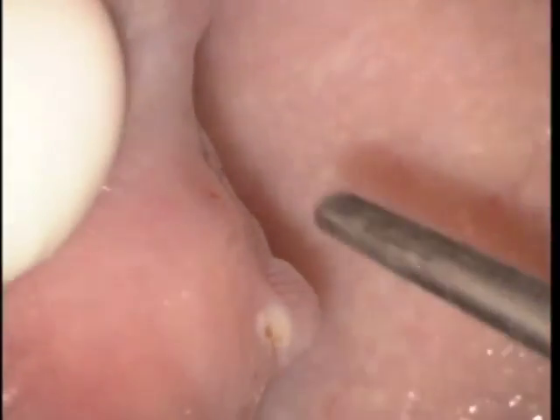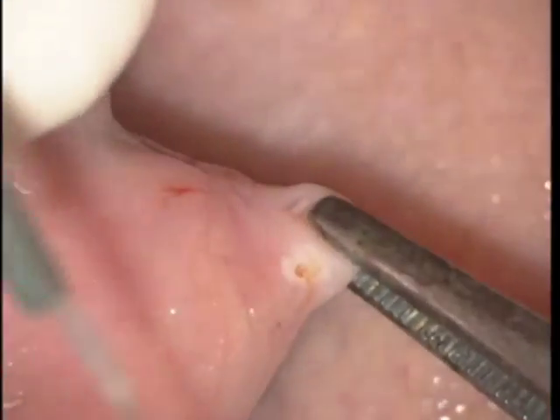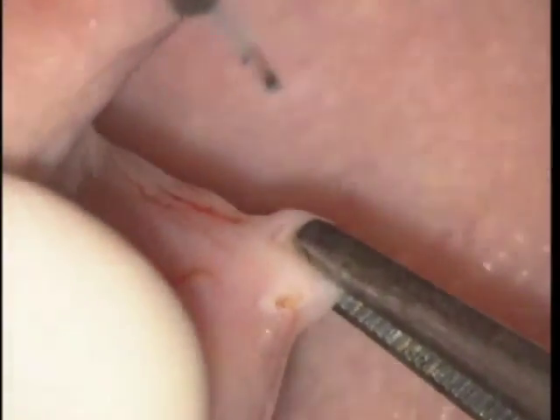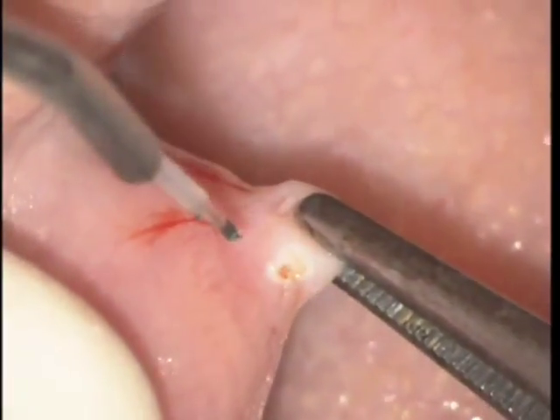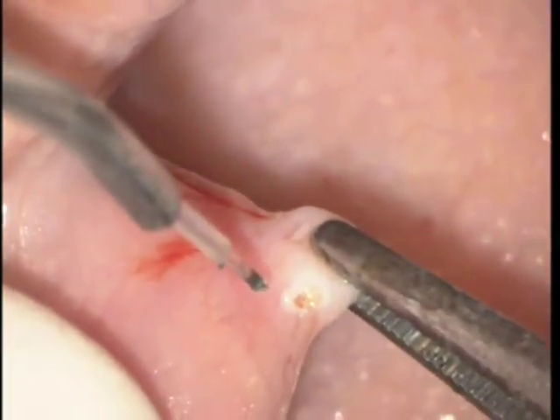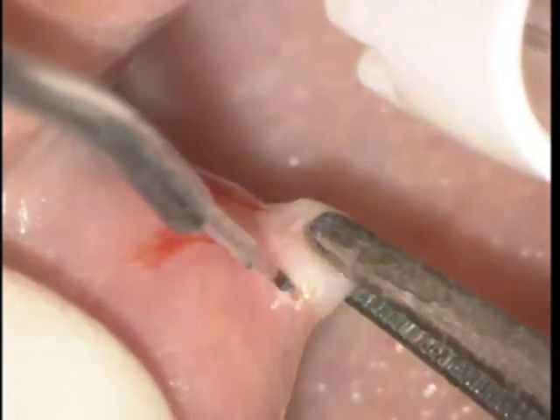We distend with one hand the fibroma with pickup tweezers or small tissue forceps, and with the other hand we use the laser. We did use anesthetic injected and we're using 1.4 watts, 30 microsecond duration of pulse, and 30 microsecond intervals.